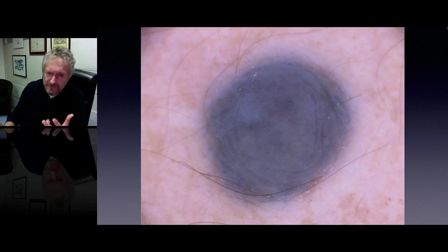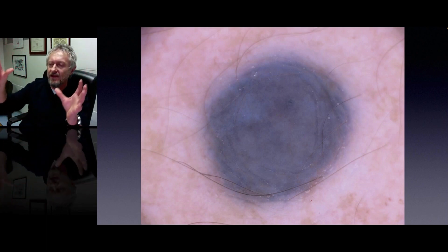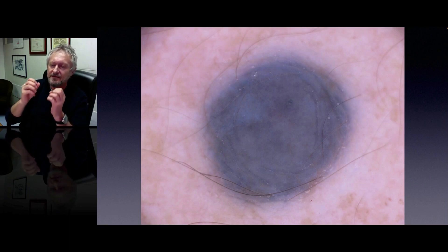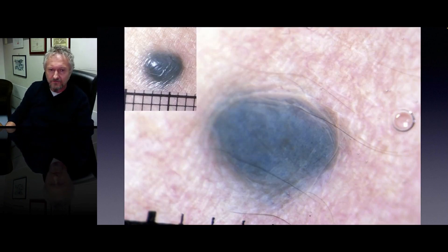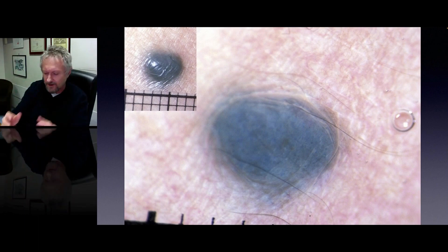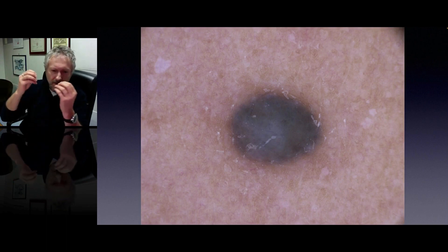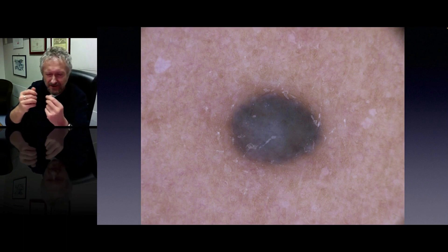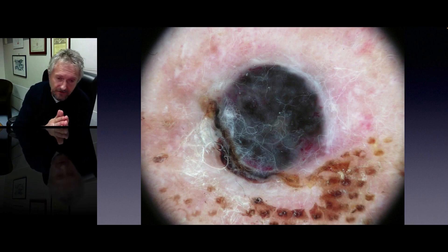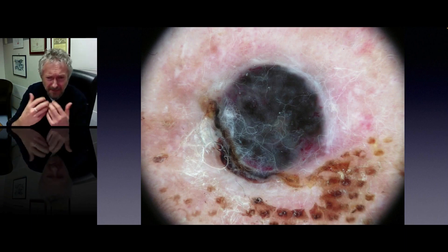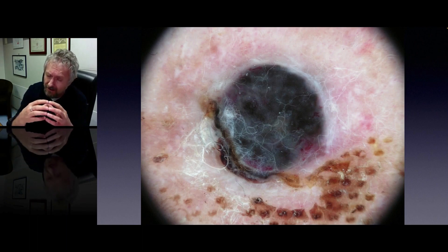The third type of nevus is blue nevus. Blue nevi are again very regular — the overall architecture is very regular — and the specific clue is the presence of homogeneous blue color. Here you see a beautiful prototype case, and here is another case of blue nevus with a very regular overall architecture and only blue color. Again, here another example of blue nevus with one-color blue. Of course you see some kind of variation here, but you must tolerate these little variations.